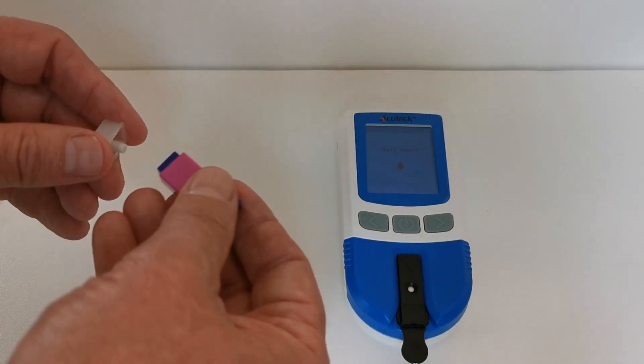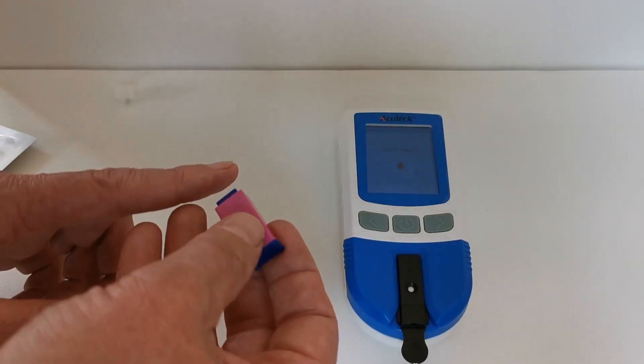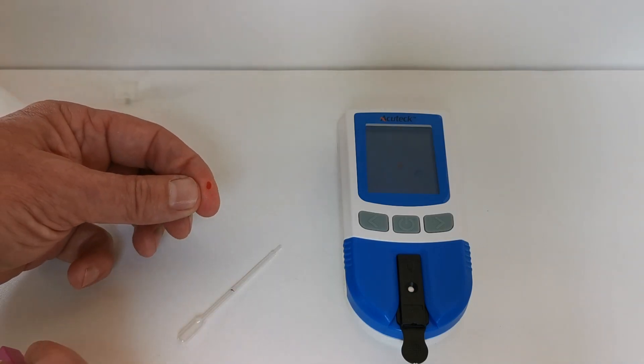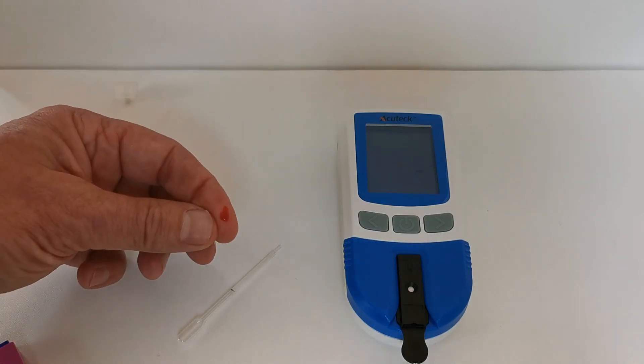We're now going to use one of these test safety lances. I'm just going to perform a safety lance to get a sample of blood.